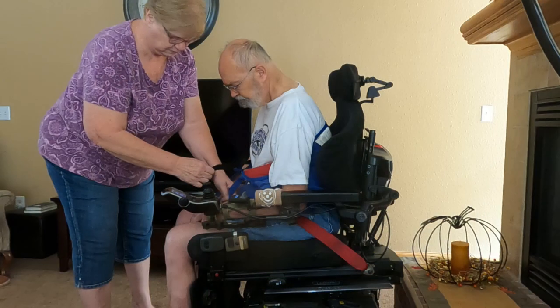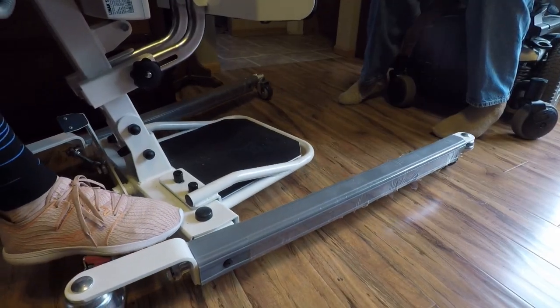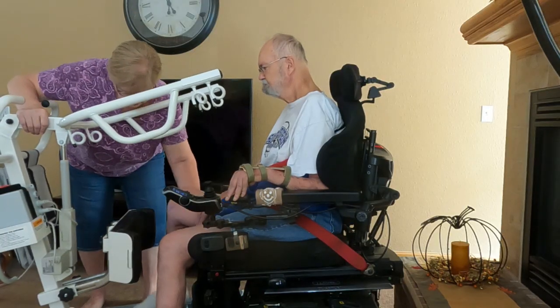belt. After snapping the buckle, tighten the internal belt so that the sling is snug. Next, pull the two sling flaps to the front of the patient and thread the two loop straps through the long black safety strap. The caregiver should then spread the legs of the lift and straddle the power chair and may have to assist an advanced IBMer lift his legs on top of the footplate.